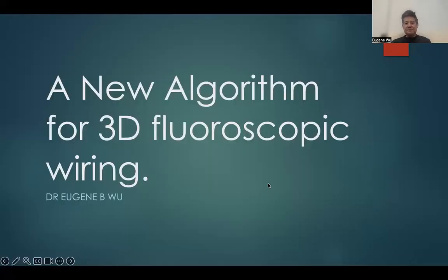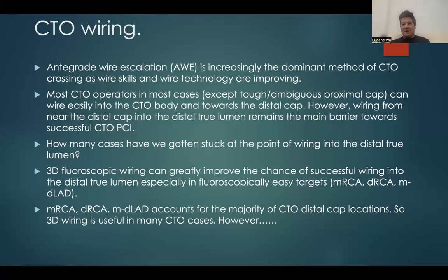In CTO wiring, over the last decade or so, there's been increasing use of antegrade wire escalation and increasing success of single wire antegrade wire escalation. This is because of improving wire skills in the operators, as well as improving wire technology.